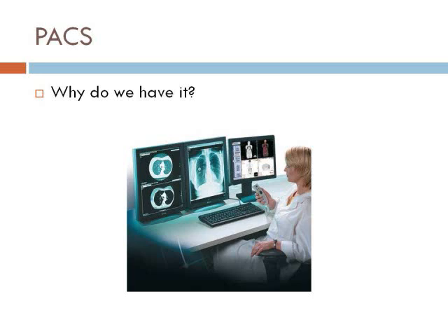So it also allows one to recognize any imaging errors, and PACS is able to correct them instantly as the image is uploaded to the PACS system. This is a good thing, and it decreases having to retake an X-ray over and over again just because of a contrasting issue or the zoom was not good enough. So it allows better and faster access.